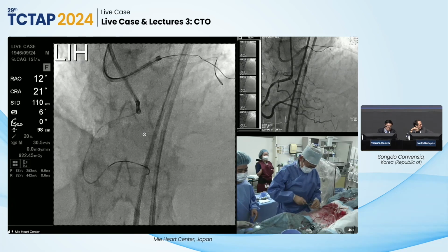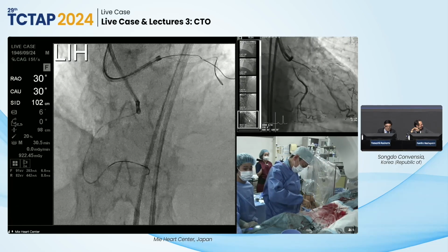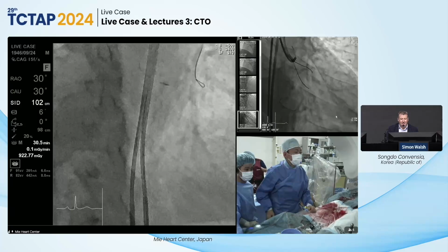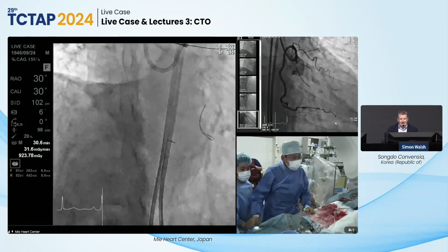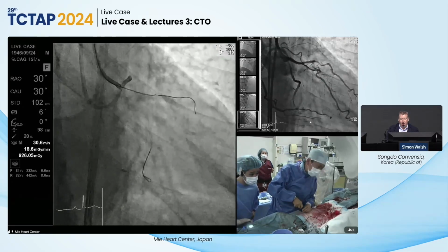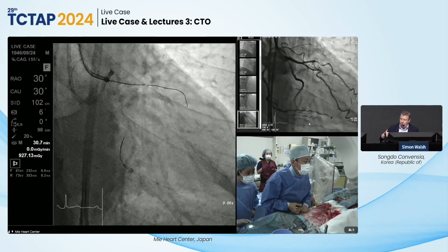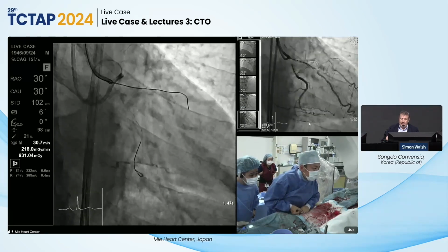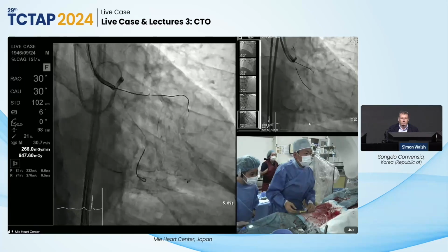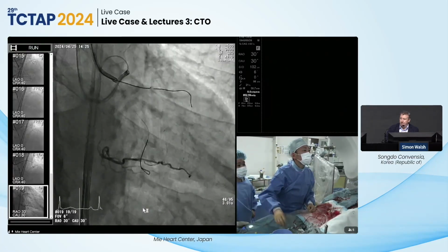I mean, at home, I'm thinking of putting a Stingray about 10 millimeters down there and just re-entering, and not messing around with those collaterals if I don't have to. Yeah, I do think that sort of equation is definitely a risk-benefit question, and ADR at the distal cap is going to leave you a very short subintimal course, which has no adverse bearing on outcome provided you re-enter the vessel where it reconstitutes. So I think it's often a very good option in this type of scenario.